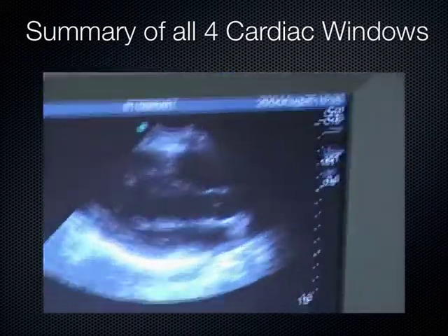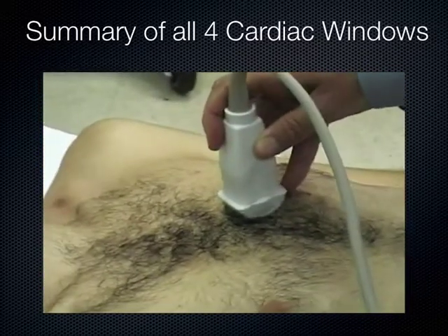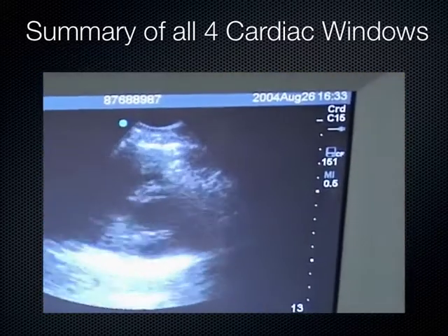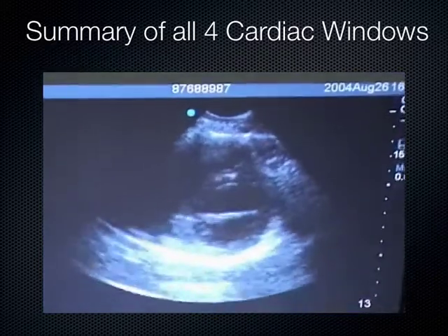If I want to do a parasternal short view, I simply take my probe and then I rotate it 90 degrees, and now you look on the screen and we'll see a parasternal short view. Sometimes we call this the fish mouth view right here because it looks like a fish mouth there.